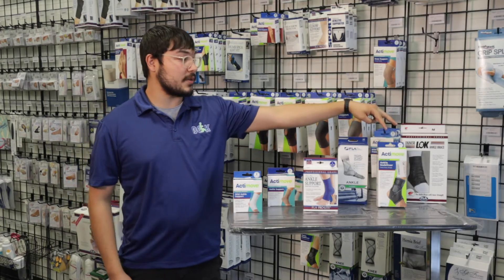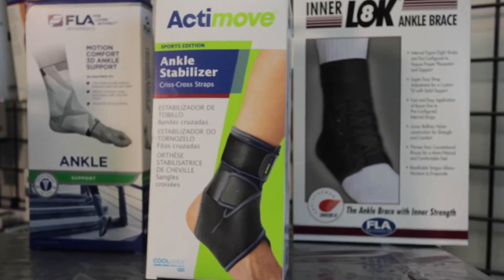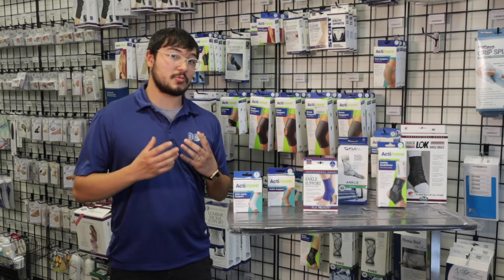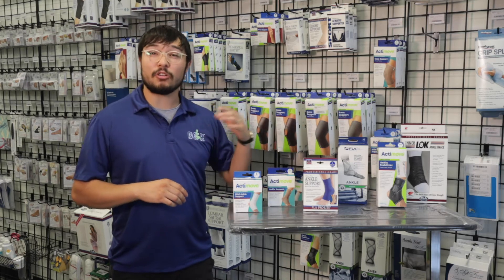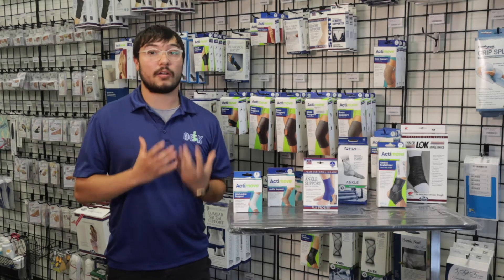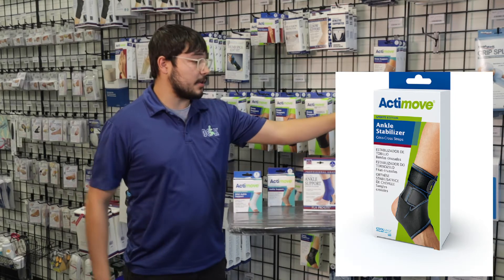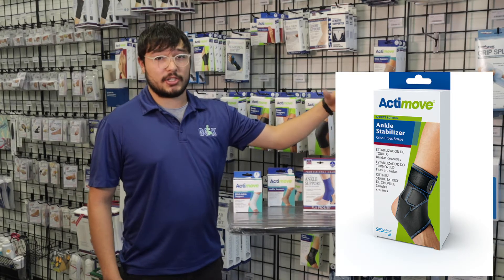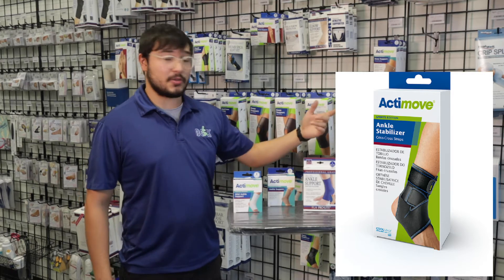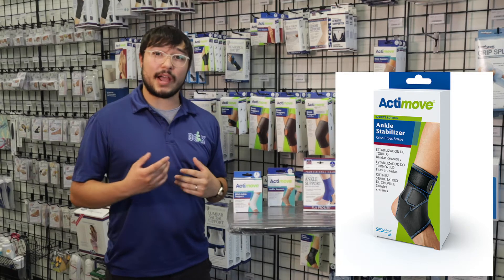Now I have two over here that are the adjustable straps and the lace-ups. These are for more serious injuries — doctors will mainly prescribe these, but you can also use them if you're playing sports or if you're active, going out on walks, things like that. This Actimove one right here has straps. You can adjust it to how tight or how loose you want it with the straps as they go across and around your ankle and your foot.